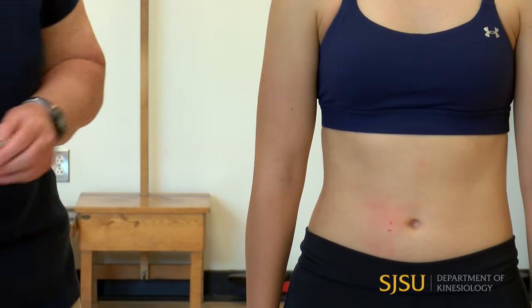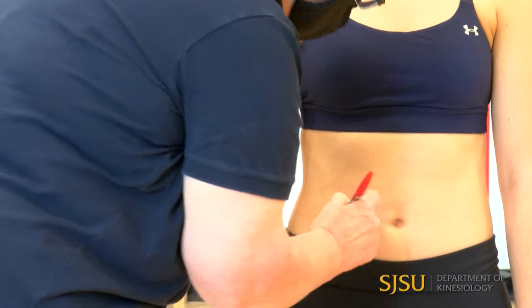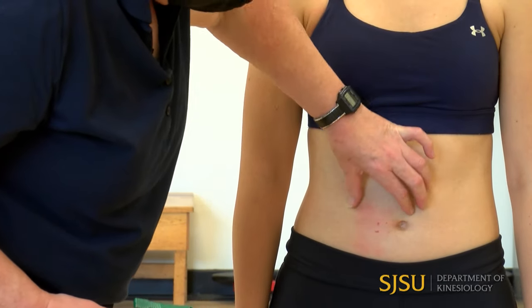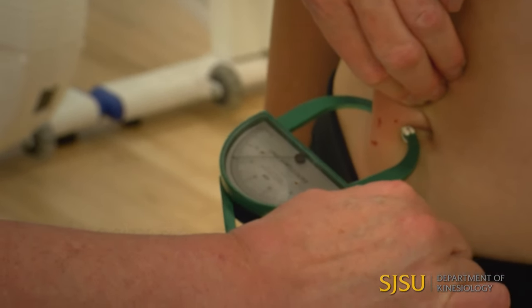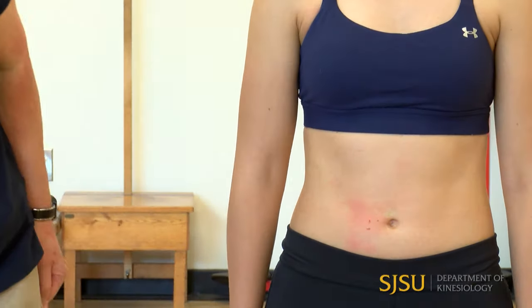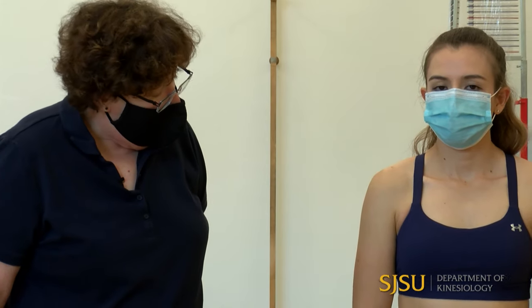For Jackson, the abdominal site is two centimeters from the umbilicus. Jackson uses a vertical skinfold, so my fingers go horizontal to create it. Caliper tips go right in there, four seconds, and I take the measurement. For each of these I should be writing down the values. I do all measurement sites once, come back and do them all a second time — just like with circumference measurements and diameters — and do a third if needed for consistency.